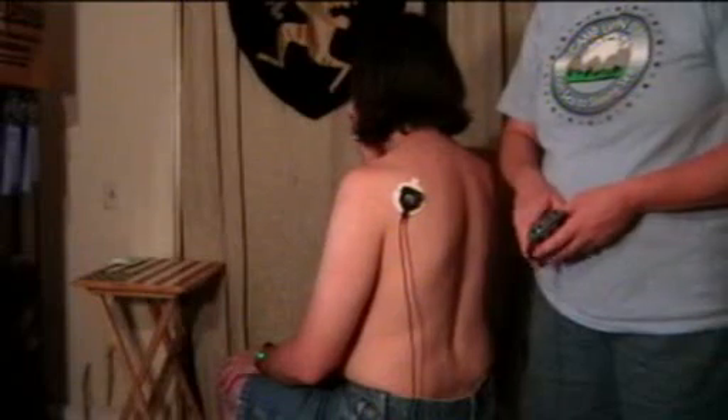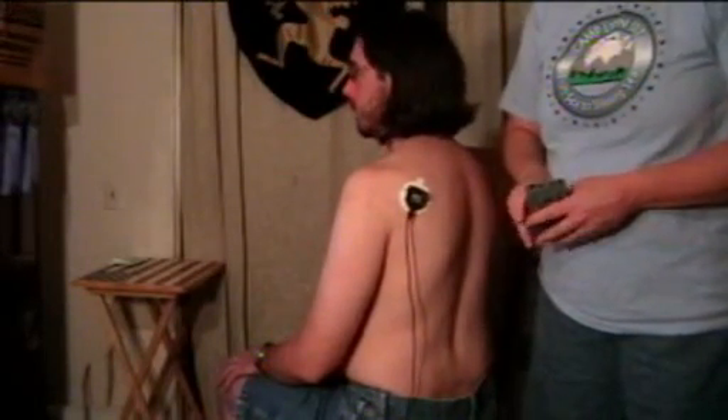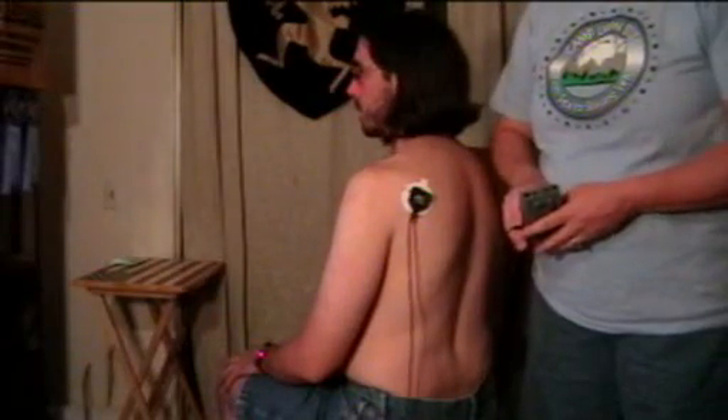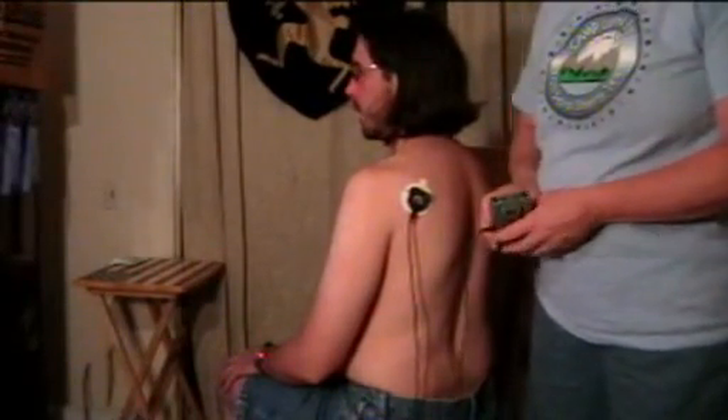There's some pretty good research out there that shows that this nerve that feeds this muscle is often quite functional, despite the fact that some people with OBPI never actually learned how to use this muscle. So with biofeedback, hopefully you'll learn how.